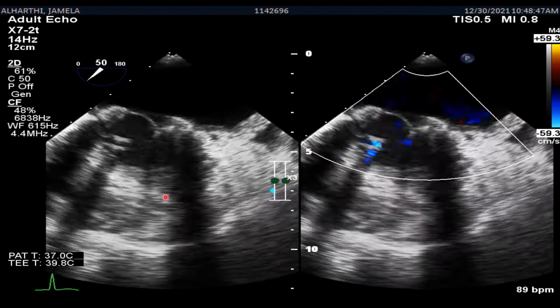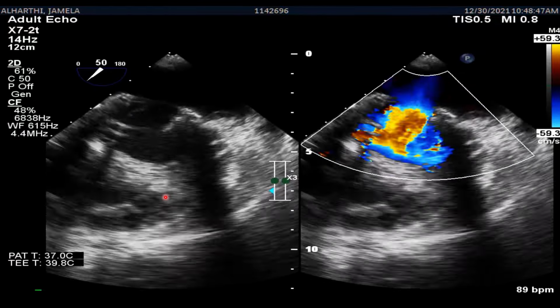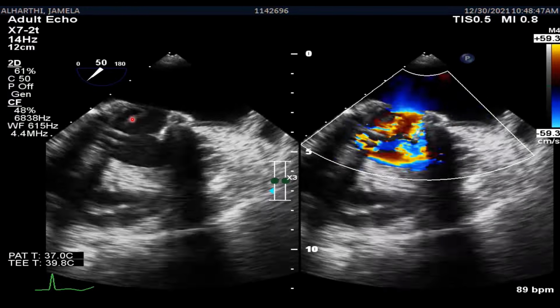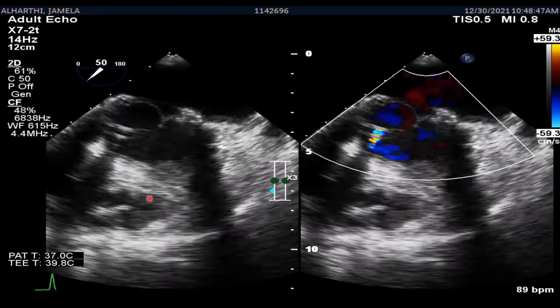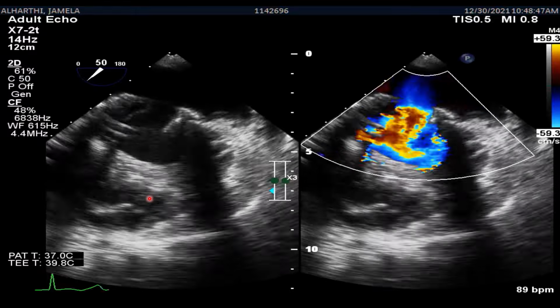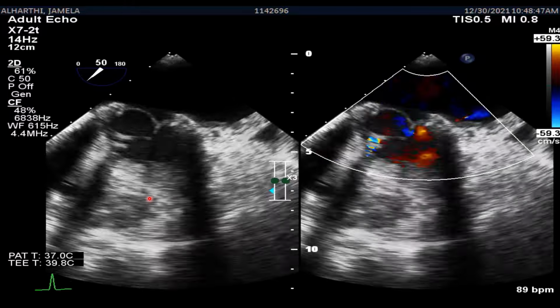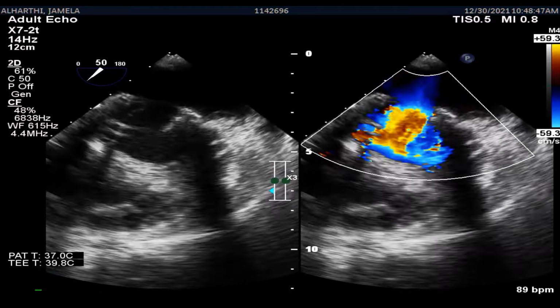The Impella passes the aortic valve, trans-aortic valve. It's just two lines; this is the way it appears in the echo. It takes the blood from the LV and pushes the blood to the aorta, so it respects the antegrade flow of blood in the aorta, and helps to unload the LV.